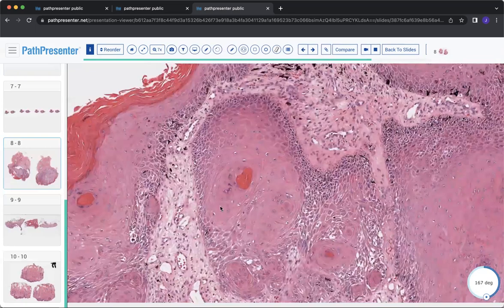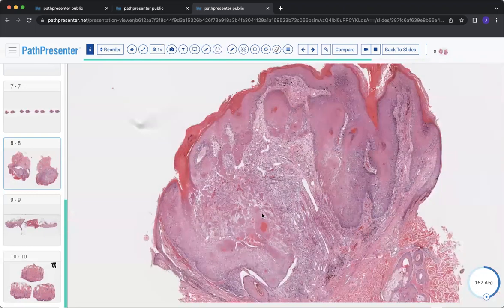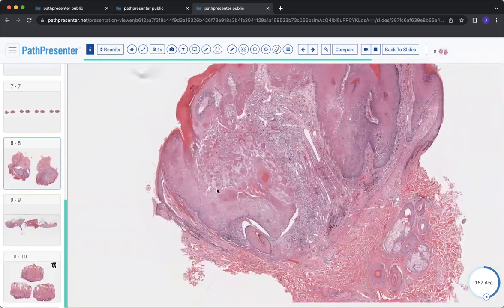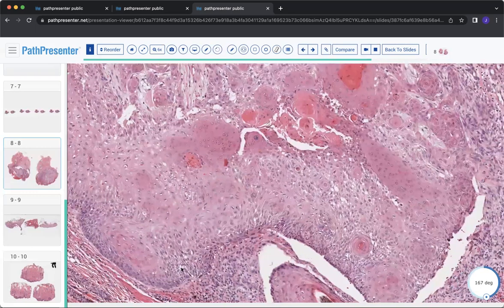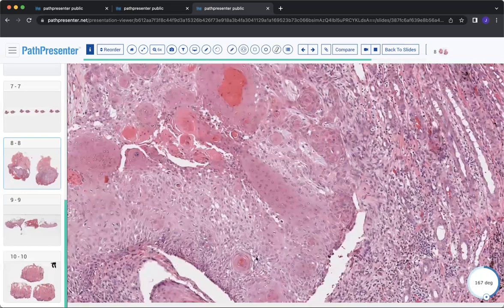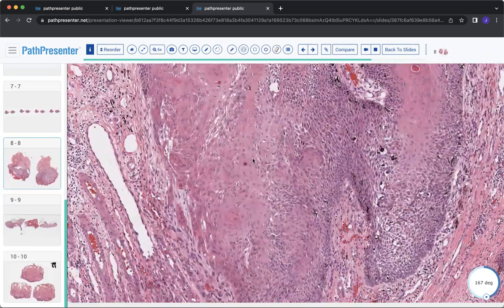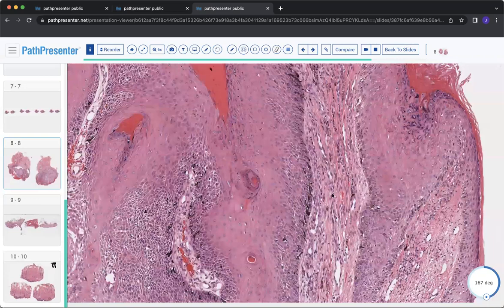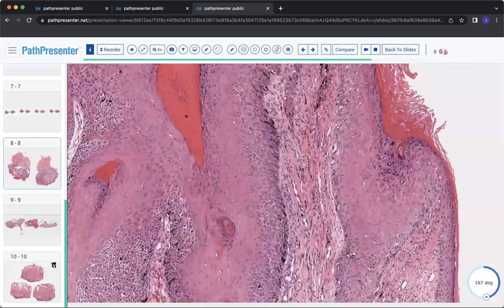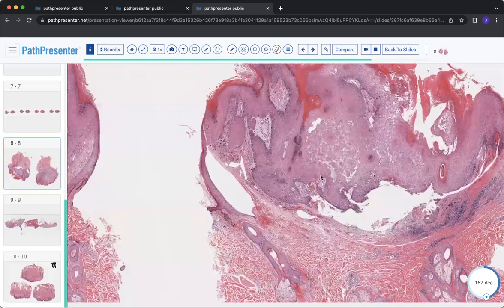So this is something that would probably have to be descriptive, where you would say keratinocyte, or you could say endophytic keratinocyte neoplasm, see comment, describe what you're seeing, talk about focal areas of clear cell change and peripheral palisading with an eosinophilic rim, say that an irritated trichilemmoma is possible. But given the numerous amounts of monotonous cell populations, many areas where you're not having that thick eosinophilic rim, and also just abundant squamous eddies, you can be thinking about an inverted follicular keratosis as well.